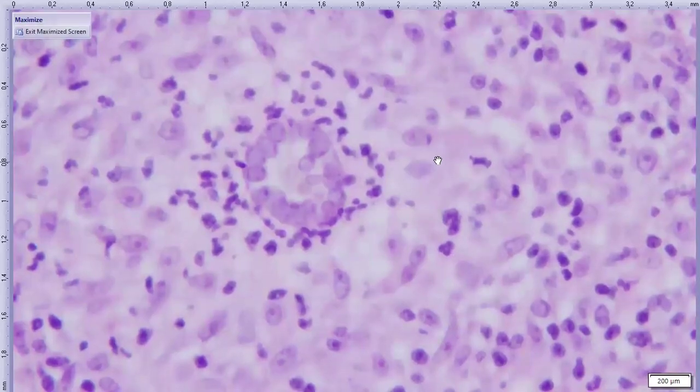So we have an endosporulating organism causing an infection in this cat. There's a short list of endosporulators that could be found in animal tissues. As a brief list for any pathology-oriented listeners out there, Batrachochytrium dendrobatidis is one, but that doesn't look like this, and it's more of a frog thing. You've got your algae, Chlorella and Prototheca, which don't look like this, generally smaller. You've got Rhinosporidium seeberi, which is generally bigger. So that leaves our last one, which this is, Coccidioides. This is most likely Coccidioides immitis, but we can't speciate reliably with histomorphology alone, so just Coccidioides species will do.